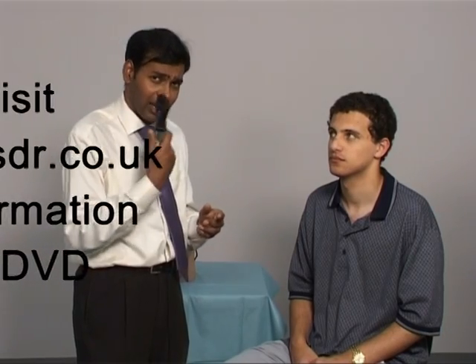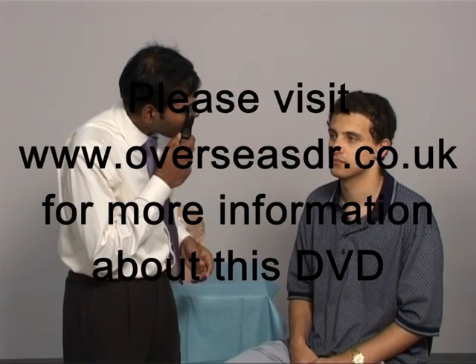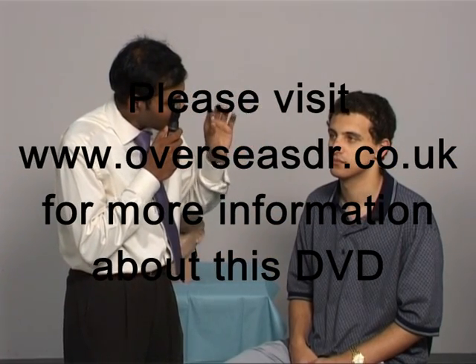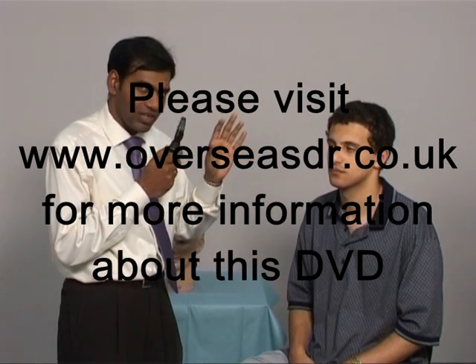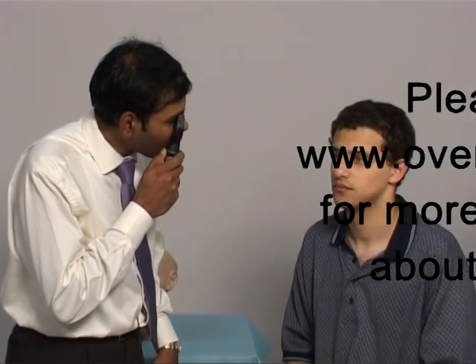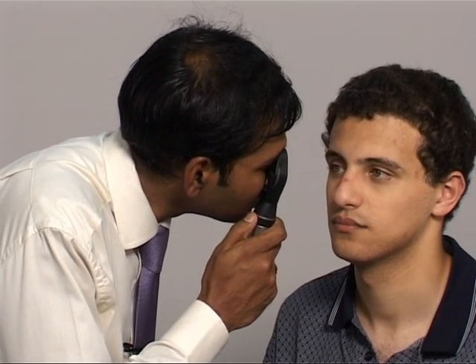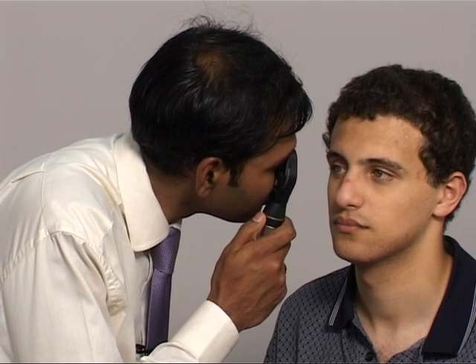And then you could examine the right eye of the patient, approaching him from his right, using your right hand and your right eye in this manner. As soon as you maintain a particular visual axis, you should be able to see the red reflex, which you may want to comment on, indicating the media is clear. Then, maintaining the same visual axis, proceed in this manner till the retina or the fundus comes into sharp focus.